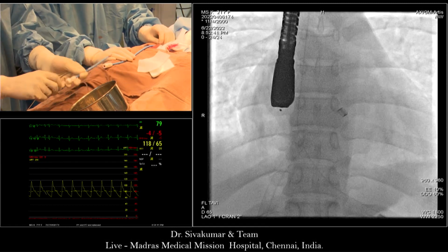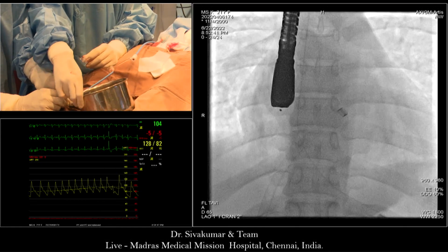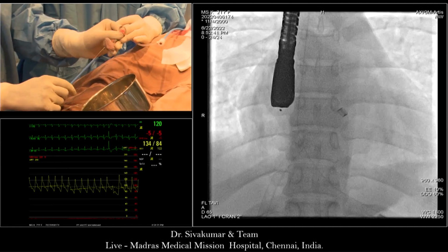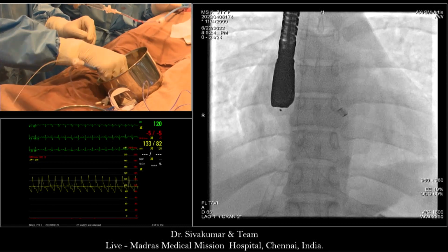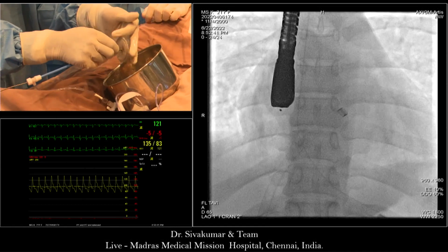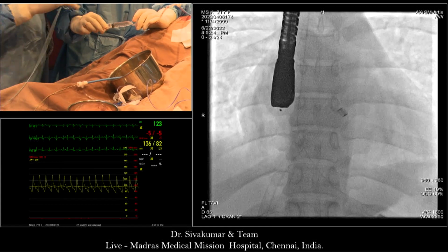Sister, I want an RCA catheter. You might have a 38 device available. No, but I feel the 40 is correct. You see that the Cobra is there. For those who've never seen the Cobra, there it is, a very good example of a Cobra. Just ask them to show that last image again whilst you're getting rid of the Cobra.